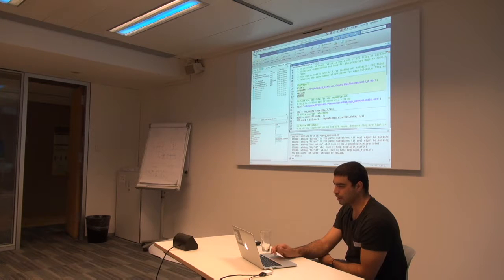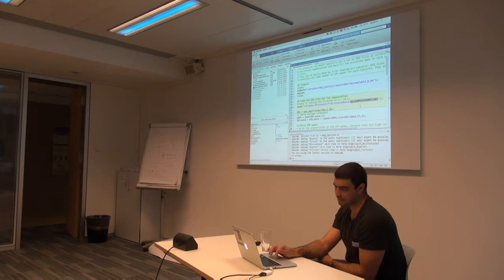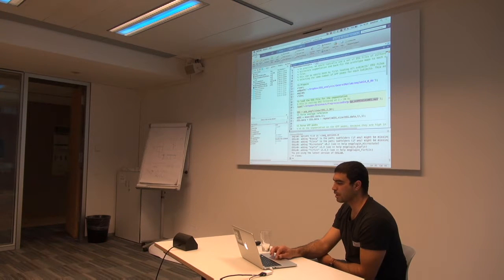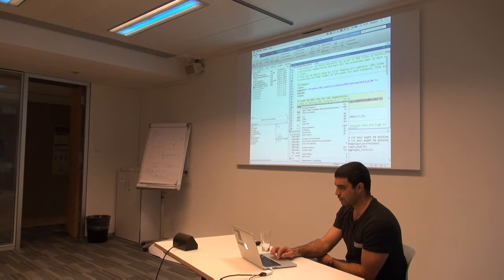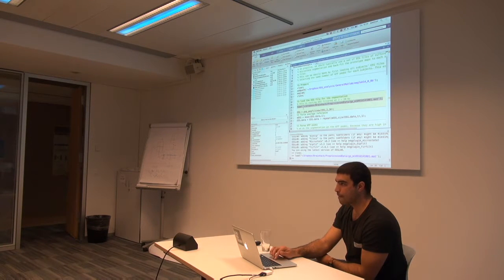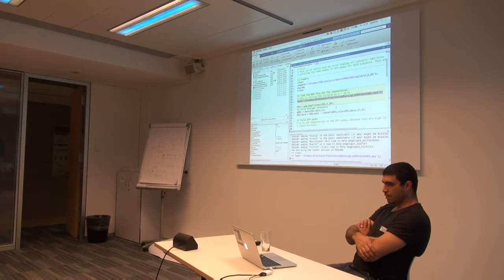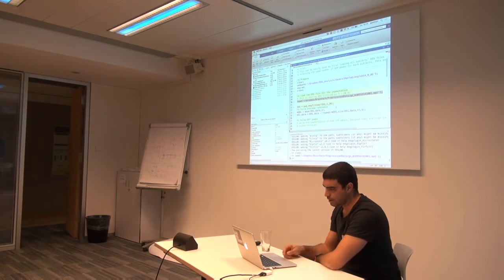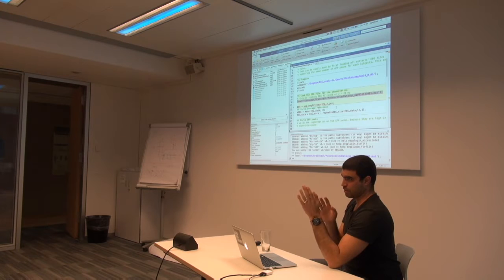Then we're going to load the data set. You can take any subject which has been preprocessed by Nicholas. Because Nicholas hasn't applied a low-pass filter and only applied a high-pass filter to 0.5 hertz, we're going to filter this data again. In microstates analysis, it's typically filtered between 1 and 40 hertz, or 2 and 20 hertz. So we filter the data from 2 to 20 hertz.